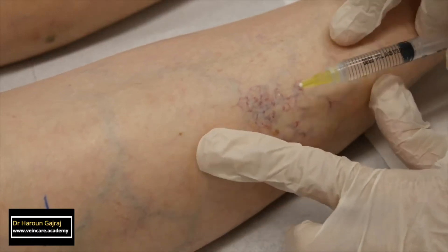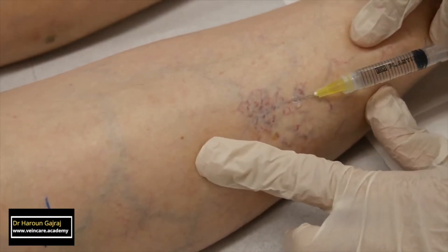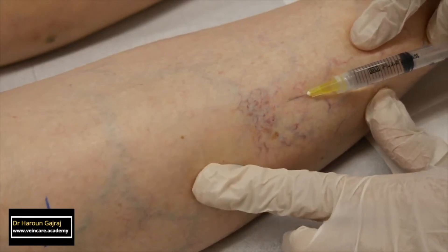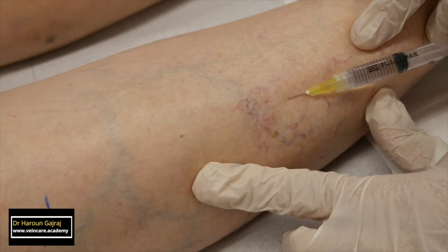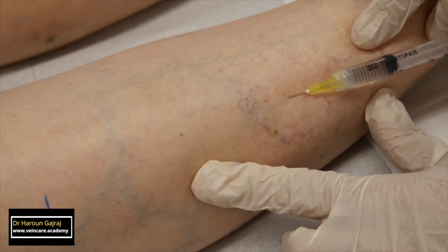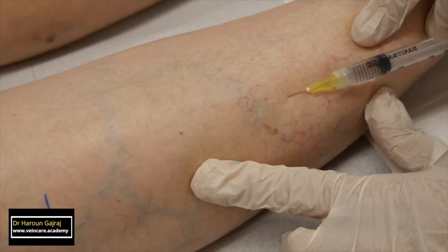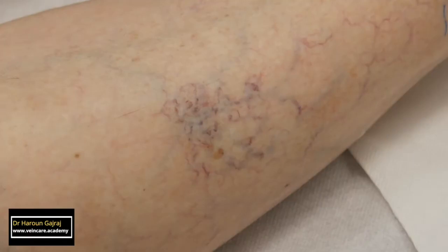The first step is to stretch the skin. I am using the index finger and thumb of my non-dominant hand, and the little finger of my injecting hand, to stretch the skin in three different directions. I am using a straight 30 gauge needle with the bevel upwards.